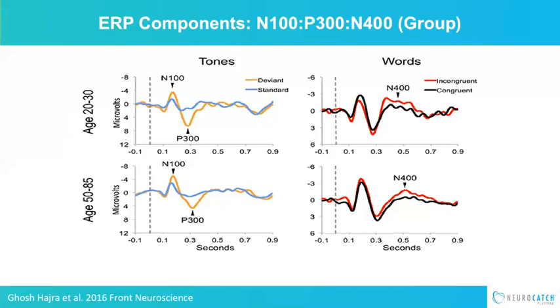Remember, I was teaching you about signal averaging, right? If there's random electrical activity, it'll average to 0. Well, here is that in practice. So we have not stimulated the brain at this time, and what you can see is the line is flat. So it's averaged to near 0 because there's just random electrical activity.